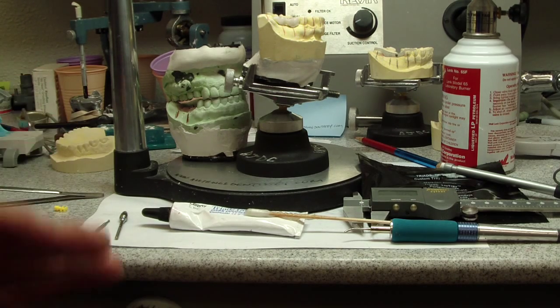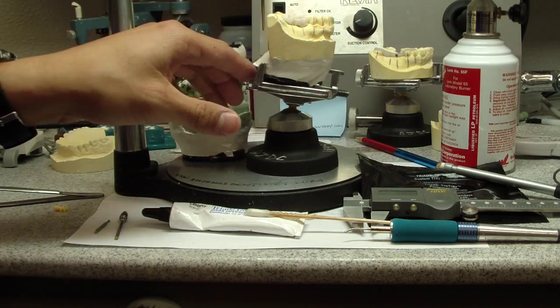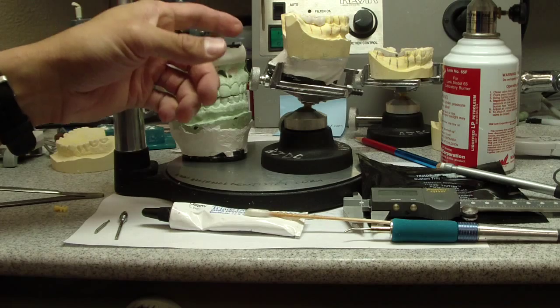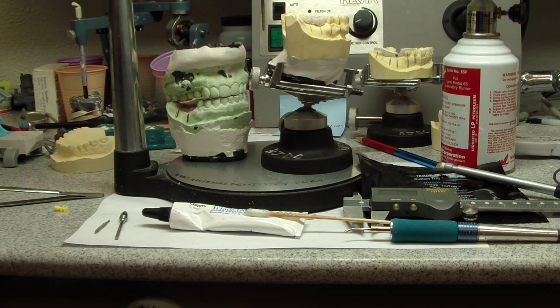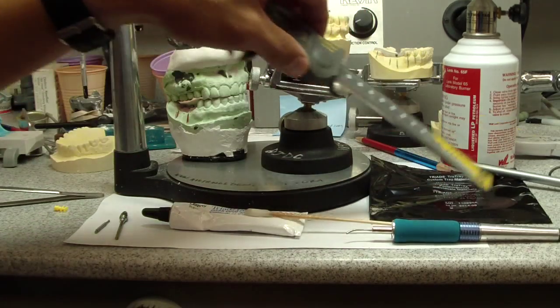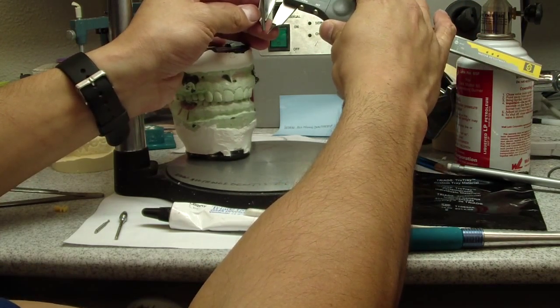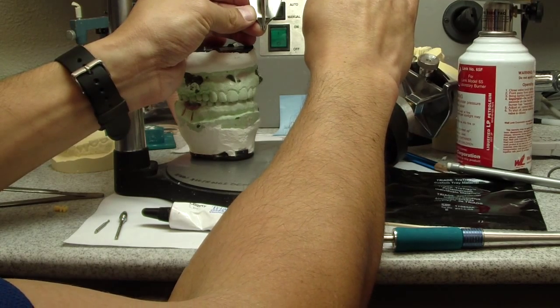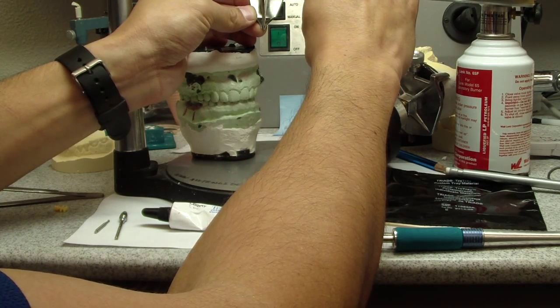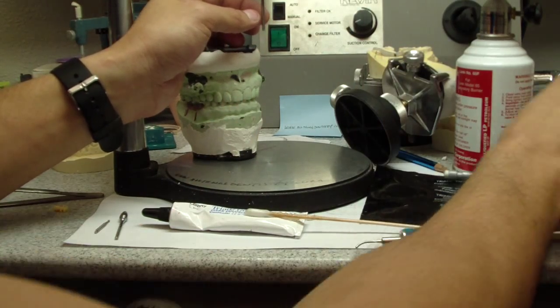Before we get started, here are some of the things you're probably going to need. First, a surveyor and some sort of stylus that replicates the 2mm twist drill, since 2mm is the diameter of one of the starting drills. Here I've used not a twist drill but something that comes with your surveyor. If you remove the end, it approximates 2mm.